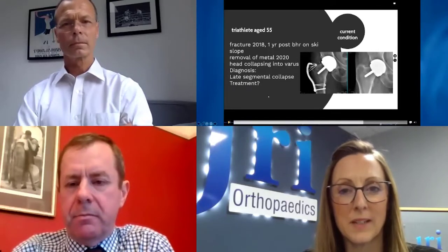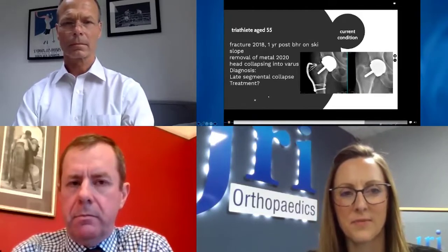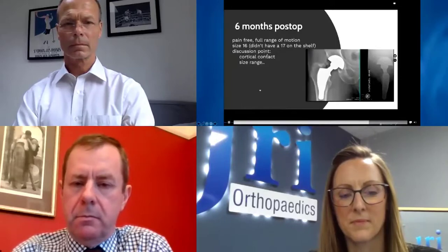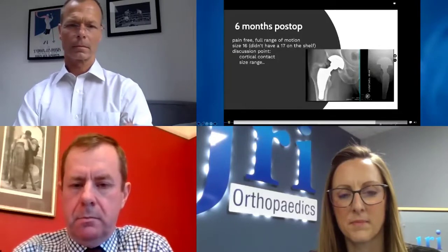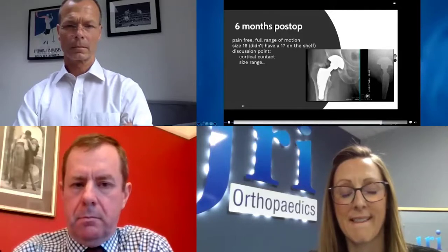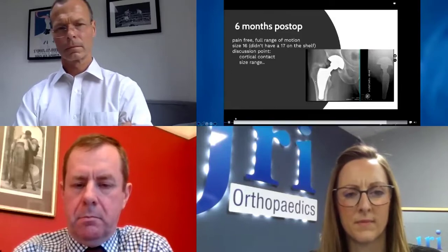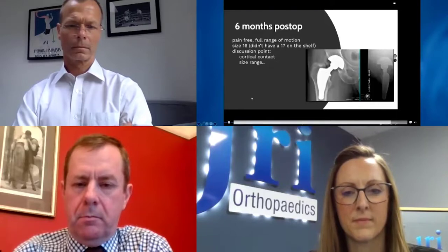Okay. And I believe we've got another case. David, if you want to play. Actually, this one is now just over 6 months post-op, pain-free. I used a dual mobility lining in his BHR cup. And this is the biggest Furlong Evolution stem we had. And it looks really undersized. No cortical contact. But actually, there's huge resistance to rotation in this very large device. But I do think there's an issue about sizing on X-ray at the very least.